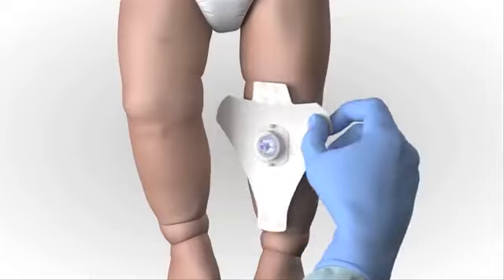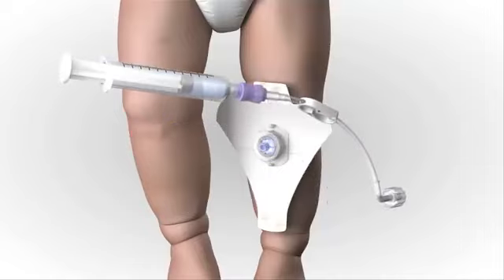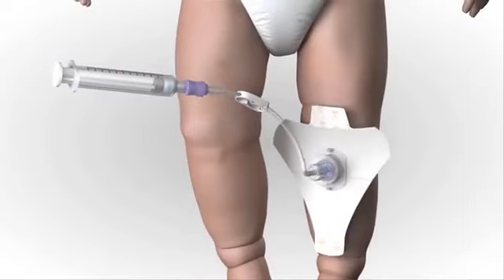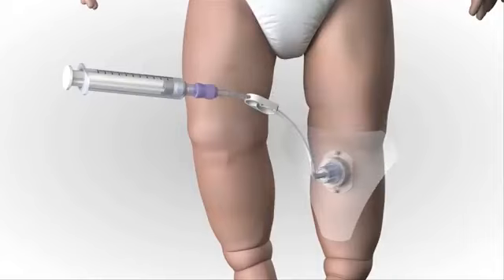Place the Easy Stabilizer dressing over the hub. Attach a primed Easy Connect extension set to the hub. Firmly secure by twisting clockwise. Pull the tabs off the dressing to expose the adhesive, then apply to the skin.